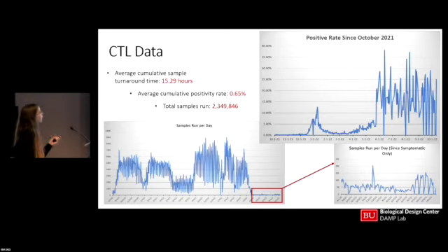And then it also correlates with this graph here. So this is samples run per day. You see these little dips. This is just for winter break and summers when people aren't as on campus. But this first year, we were doing around 6,000 to 7,000 COVID-19 sample tests a day, which was possible because of all of the automation equipment that we had. But then in 2021, with variants and other such factors, they decided that we needed to be able to test even more.